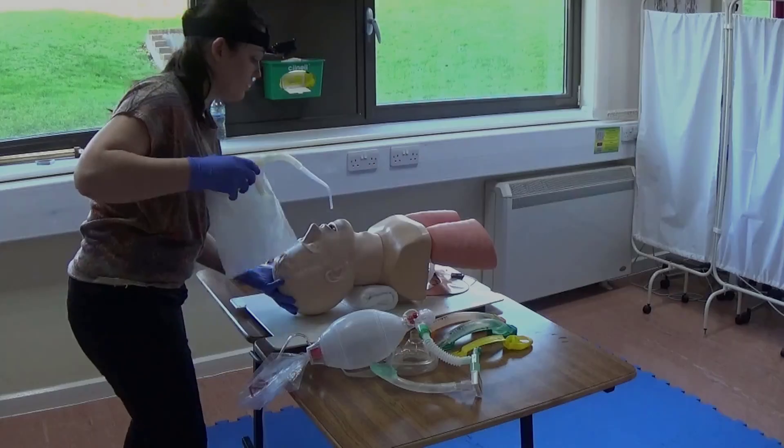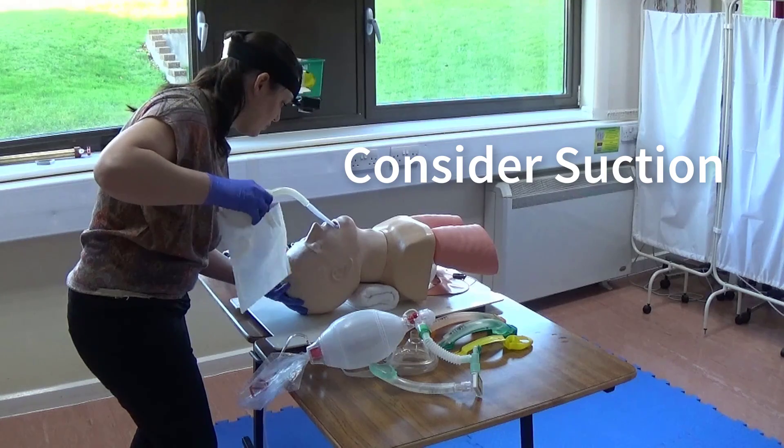First, we're going to check that the airway is clear and we're going to consider using suction if required.